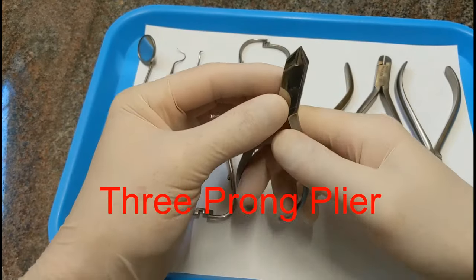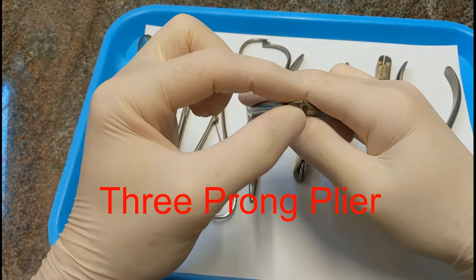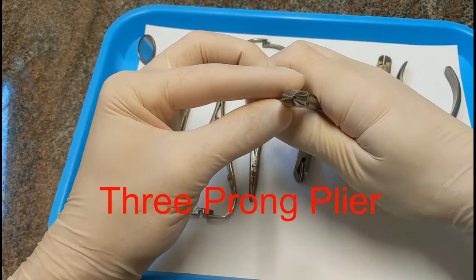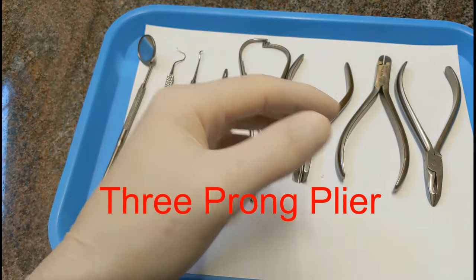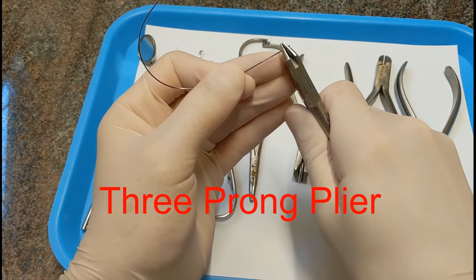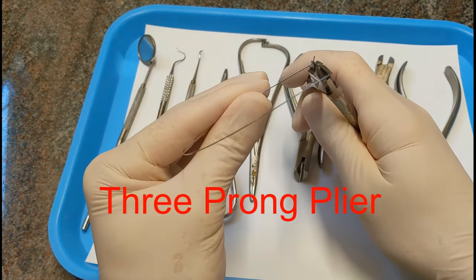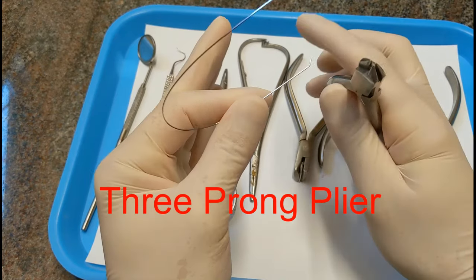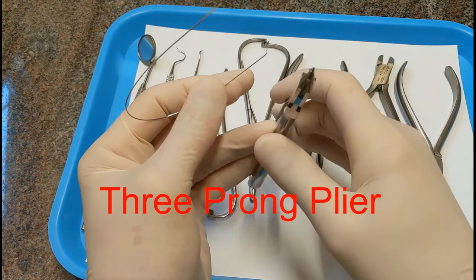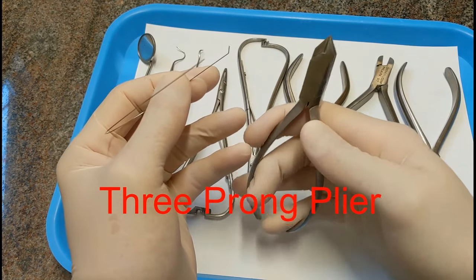This is called a three-pronged plier because it has three prongs — one on one side and two on the other. This is also for putting bends in wire. When you squeeze a wire with it, it puts a little V-bend in it, because one prong grabs on one side and two grab on the other. We'll use these when shaping a retainer wire for placing a fixed retainer.